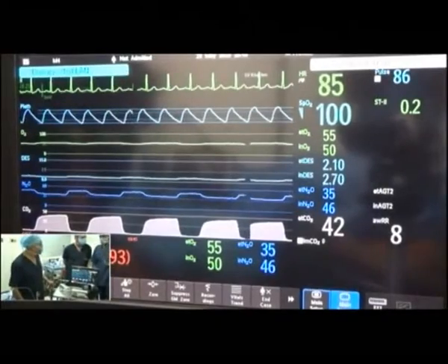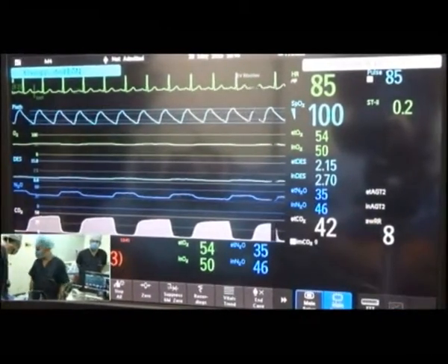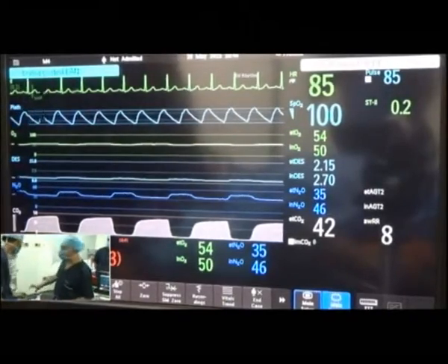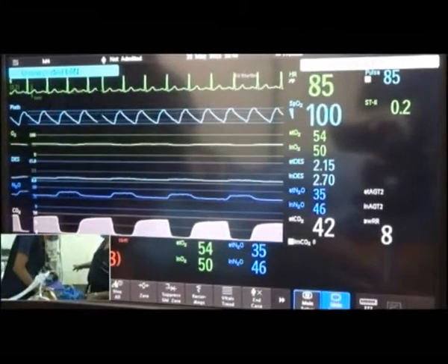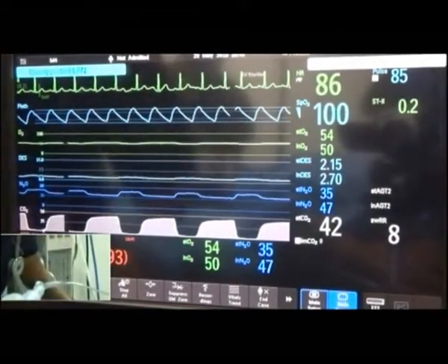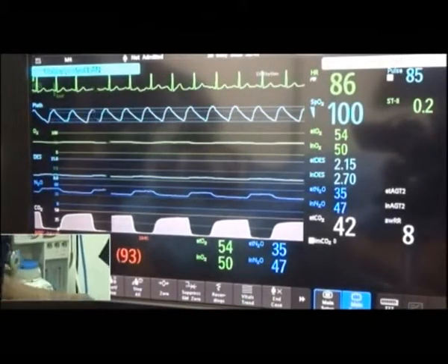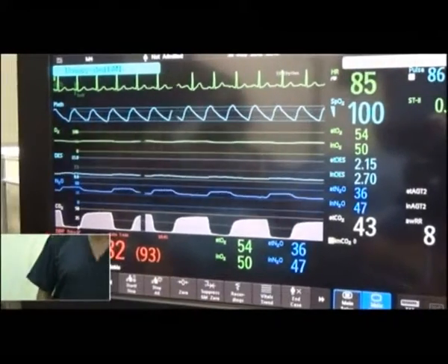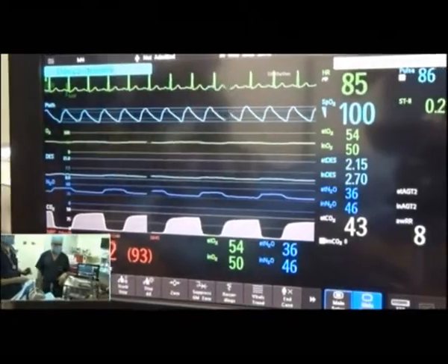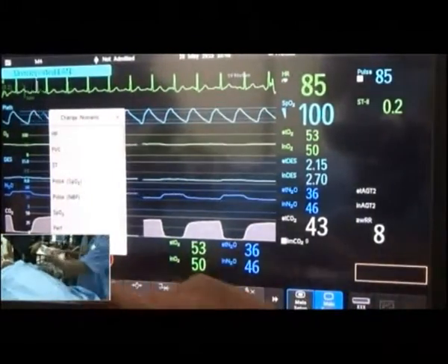Minimum alveolar concentration. If you don't have it, it's okay. Bala? Yeah, bring down the flow, with your permission, 0.5 and 0.5. The total flow is at the most 1 liter. Typically, I would go down even further. So we are going to monitor the train of 4 response, or do you have the card? Okay, we can just monitor the train of 4 response.